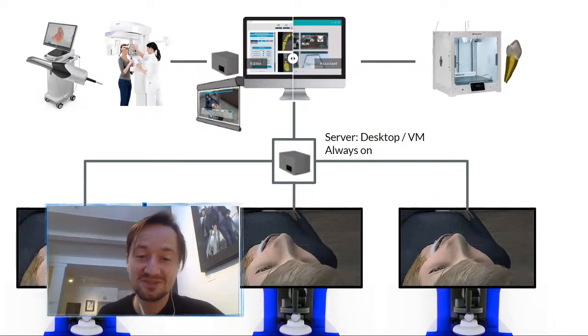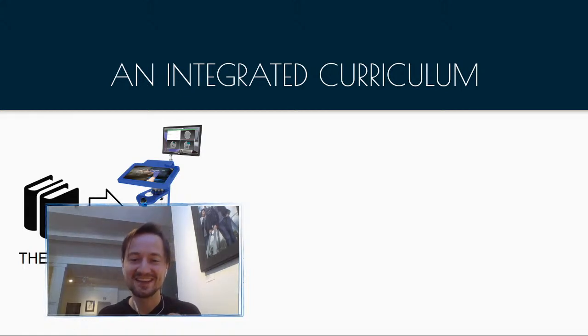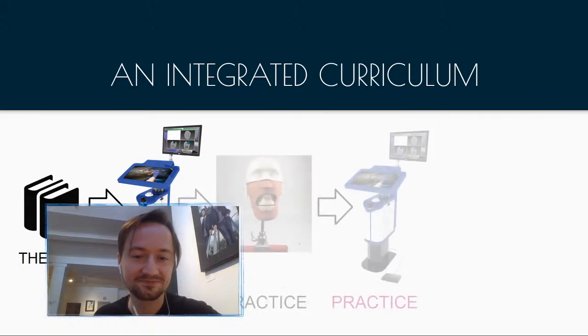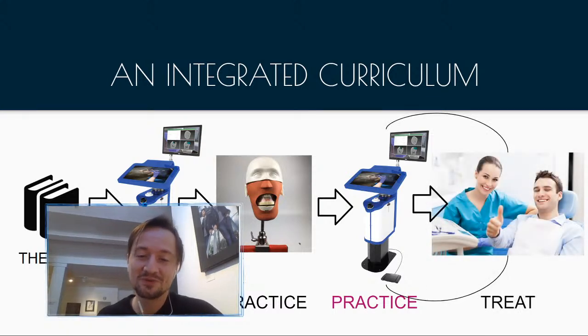So this new simulation curriculum looks like this. In the first year, you can do a mix of theory and simulation. So the students actually get some hands-on experience. Then they go to phantom heads and mix with the simulator and the virtual patients. Then when we go on to treat patients for the first time, we can actually practice this in advance on the simulator by importing those STL and DICOM scans.